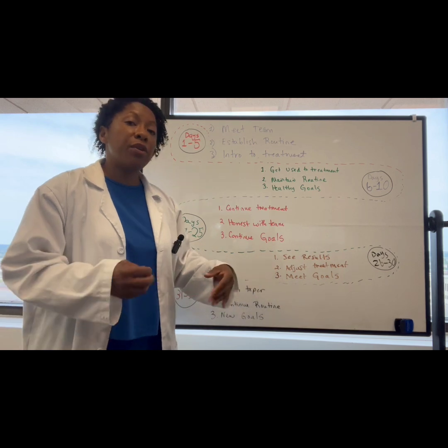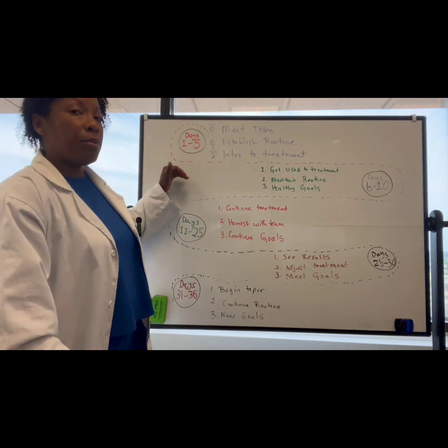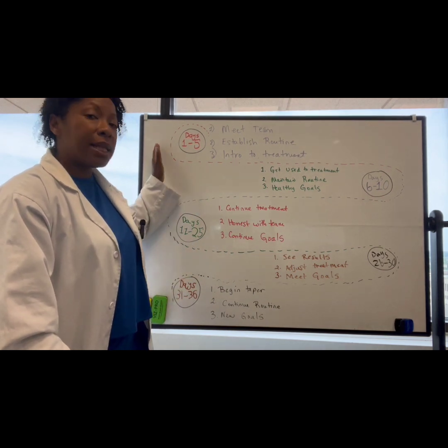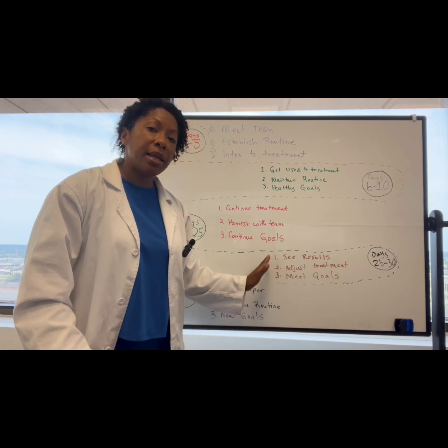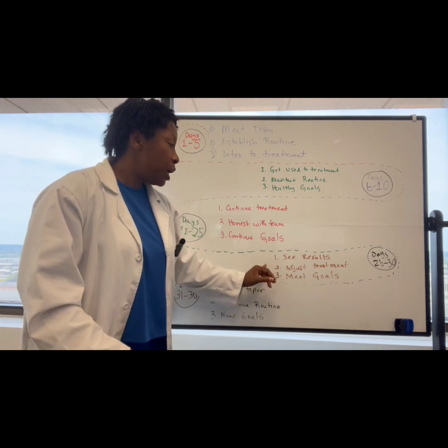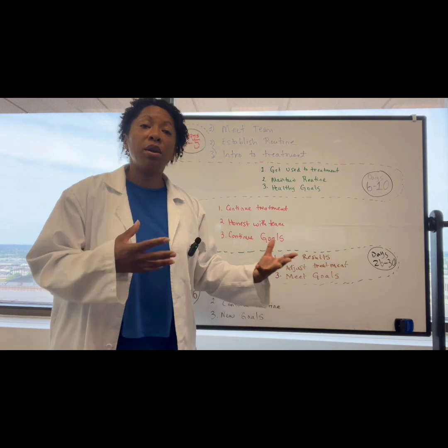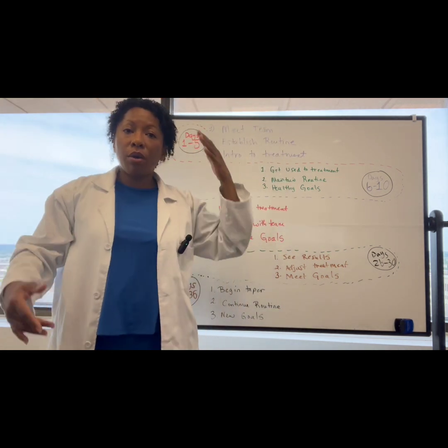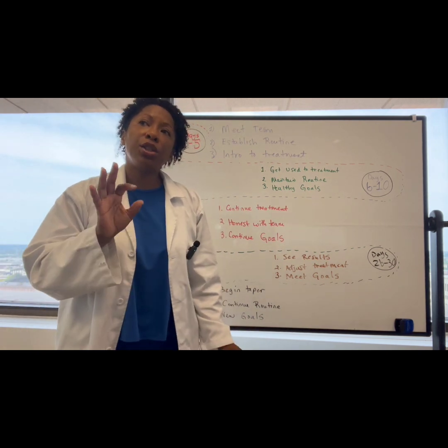And here is where, if you're not noticing as big of a result, in our clinic, we're doing PHQ-9s or BDIs. These are assessments that we're doing as we go along, or GAD-7s, HAM-Ds, HAM-As, something as an assessment depending on what your situation is. If we're not noticing major changes, then we may adjust the treatment. You may notice that your provider says, I want to go from the left to the right, or I want to go from the left frontal to the middle. There's all kinds of reasons why a person may adjust the treatment.